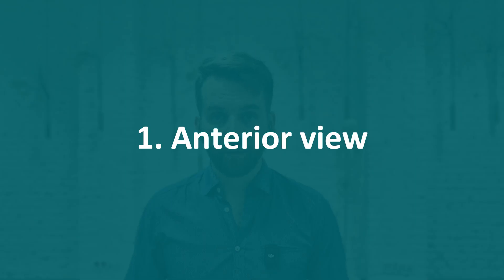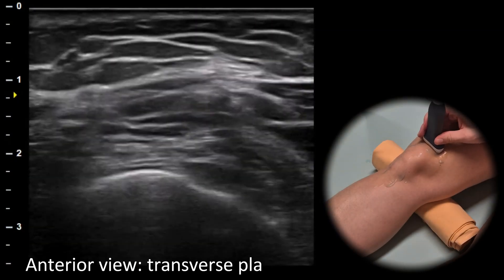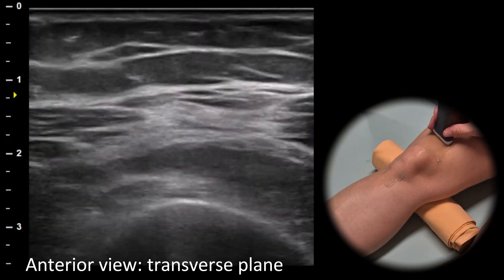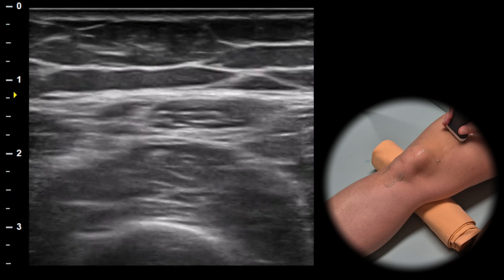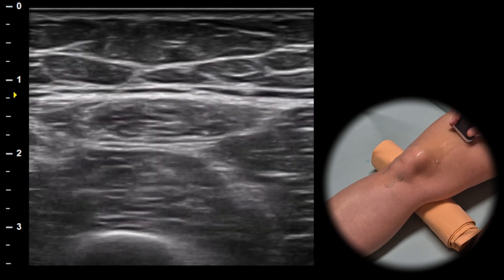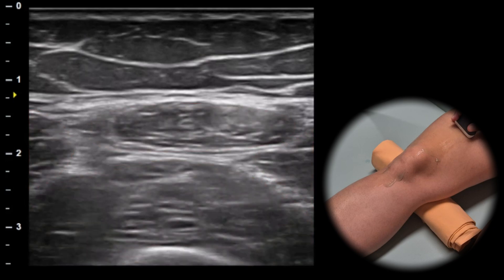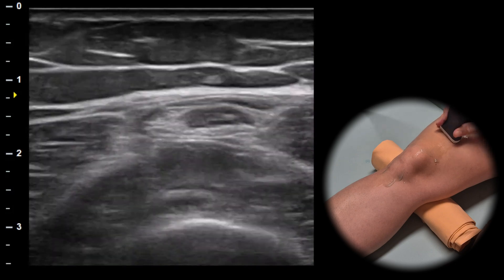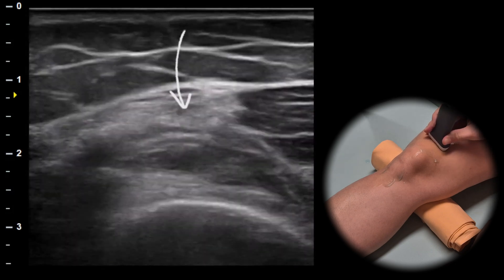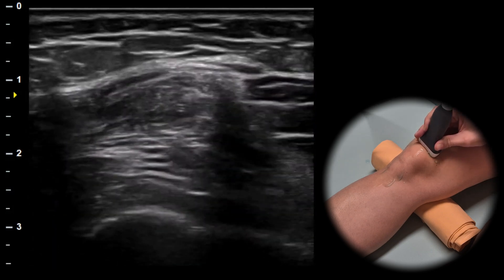The examination begins with the anterior view, starting in the suprapatellar area. In the transverse plane we can evaluate four parts of the quadriceps muscle: rectus femoris, vastus medialis, vastus lateralis and vastus intermedius. We can follow these muscles distally until they form a quadriceps tendon and attach to the patella.